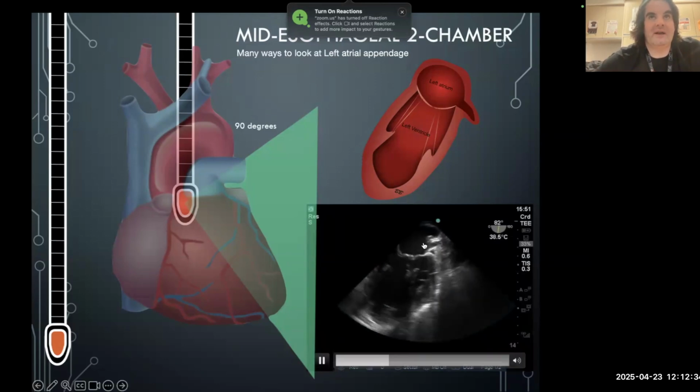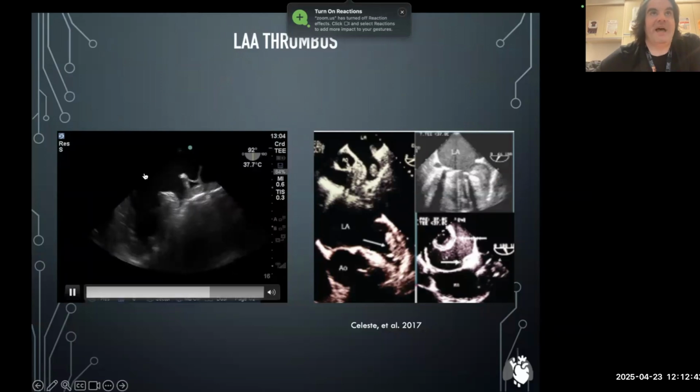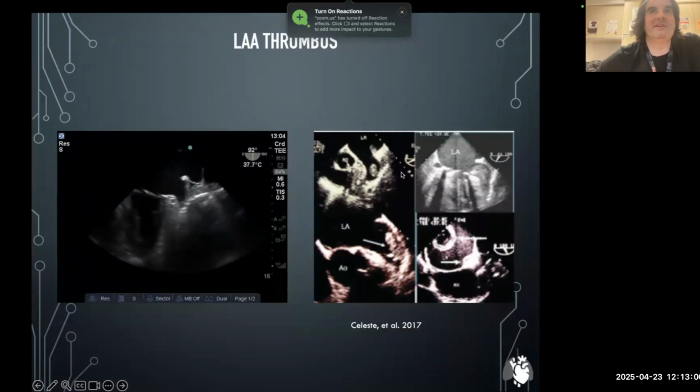We also look at the ejection velocity of the atrial appendage as a predictor of thrombus risk. Here, for example, this is a pretty generous left atrium. You could store another, smaller left atrium inside this one, like a little nesting doll of atria. So these are things that you look at categorically and think right out of the gate, well, maybe there's a thrombus there. And you can see different examples here of thrombi seen within the atrial appendage.